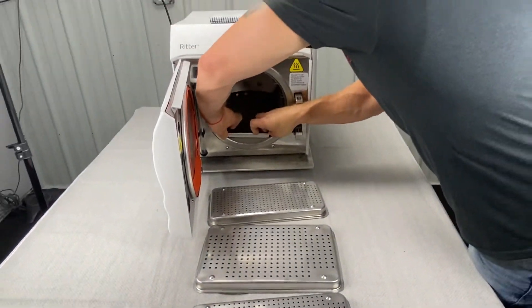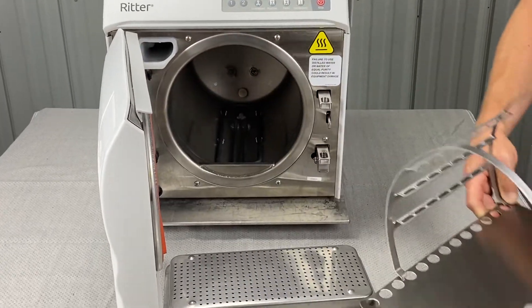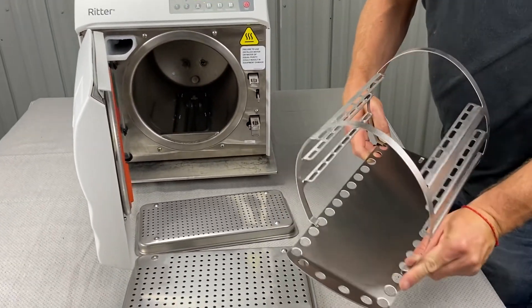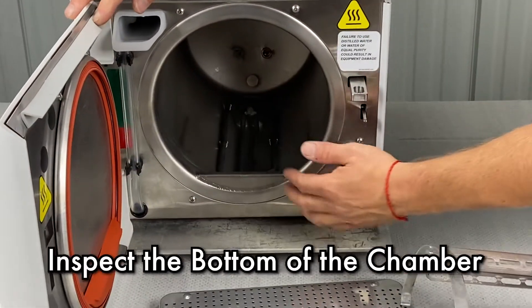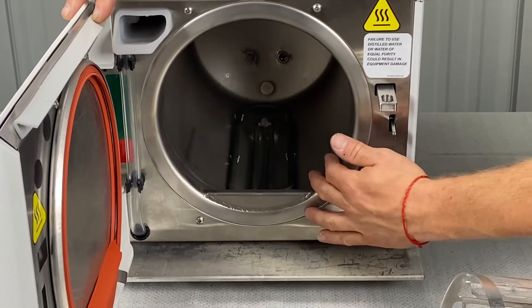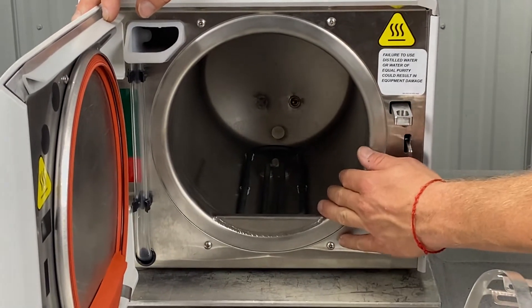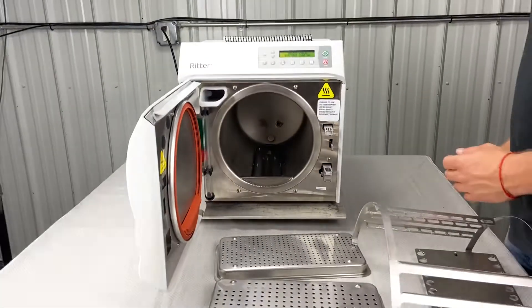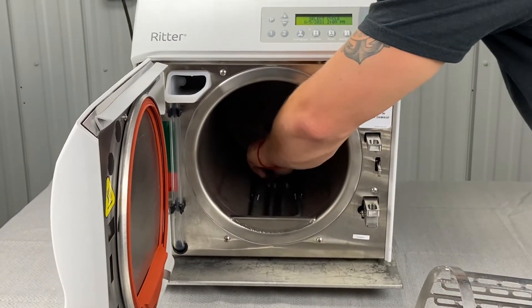You're going to pull the rack and tray plate out like so. Obviously make sure that's clean. Now we can inspect the bottom of the chamber and make sure that you don't see any paper under there, any needle tips, any plastic or rubber. Whatever you may be sterilizing, pieces can break off and fall off, so you want to keep an eye on that.